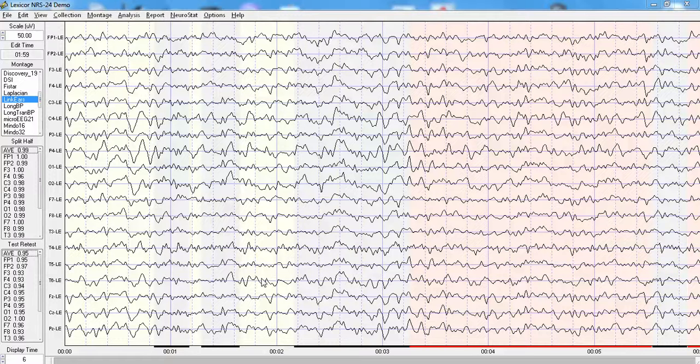The method that we use is referred to as the phase slope index, developed by Guido Nolte in 2008, and subsequently has been tested in numerous publications and compared to the other method that's often used for effective connectivity, referred to as Granger causality. The Granger causality is less accurate, especially when there's noise, and many times it fails completely in properly estimating the flow of information. It also is more complicated to calculate, involving autoregression and other methods.